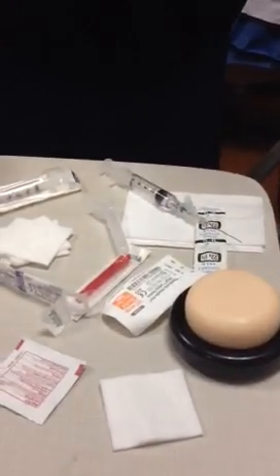What do you put on before you start finding landmarks? So you put on the gloves before you find the landmark, instead of finding it, taking your gloves off, and finding it again. I don't know if that makes sense on the video.